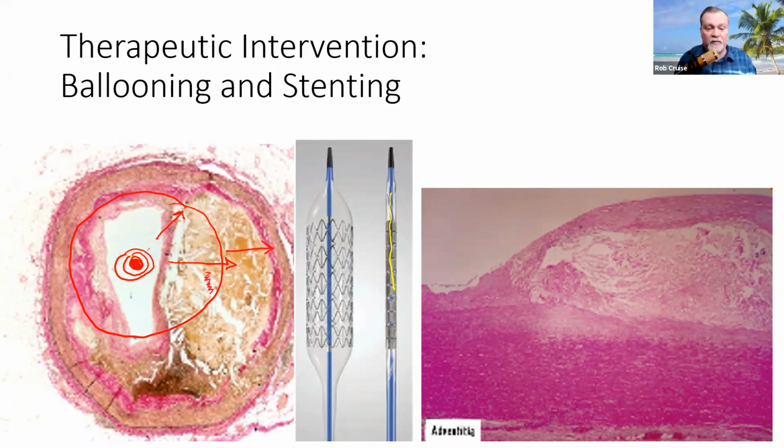You see you have these dead spaces here, so it's going to compress all that downward. And if it has to, it will move the vessel wall out too, until the lumen is now nice and thick. So your lumen now, instead of being stenotic, is going to be this wide, because the stent is going to fight against the external forces to recollapse that and have it re-stenose on you.